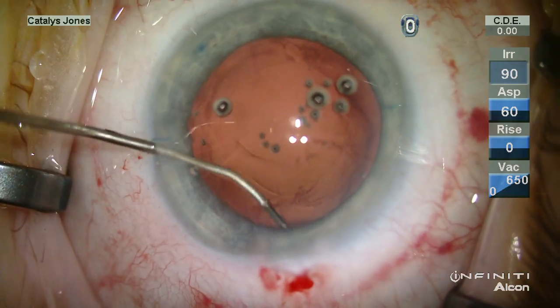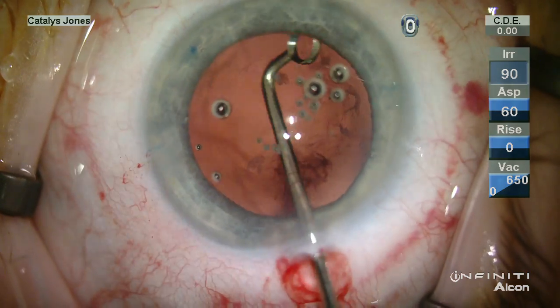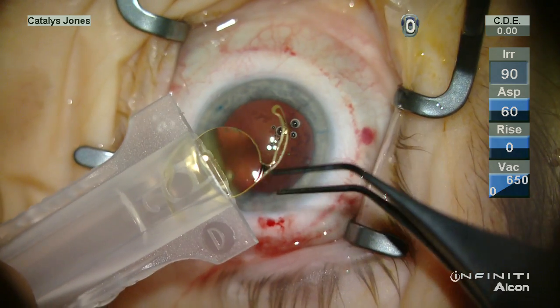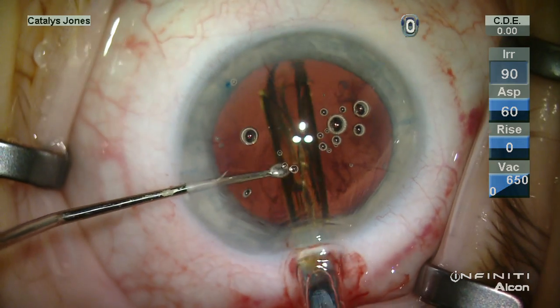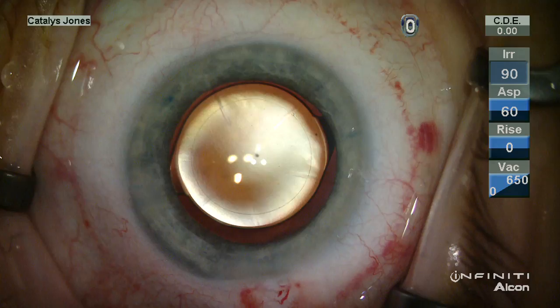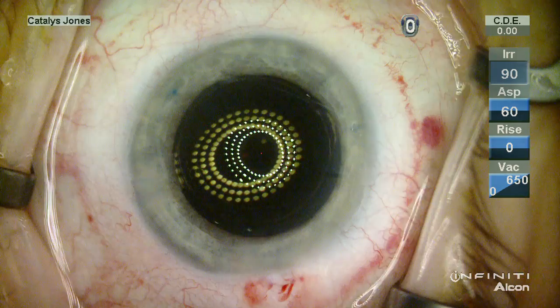After polishing and curating the capsular bag, I'm going to prepare the lens for implantation. It's a toric lens as I mentioned. I use a wound assist technique, and the lens is secured within the capsular bag with the orientation of the toric lens confirmed using a Mastel keratoscope.